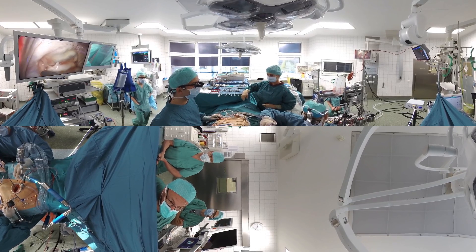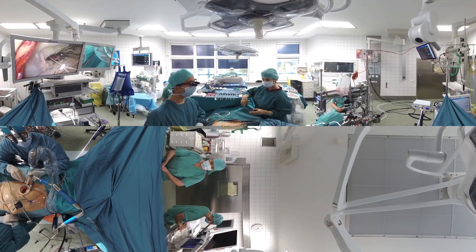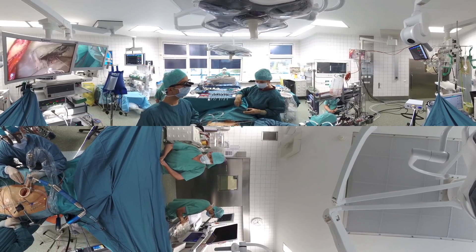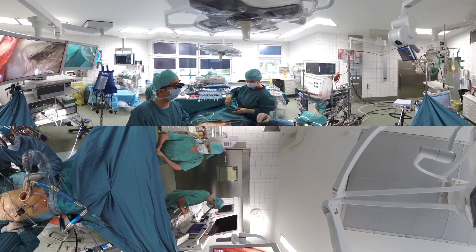In this case, we see that the posterior leaflet is markedly elongated with multiple broken cords that normally attach the leaflet to the papillary muscle. A water sealing test is performed in order to confirm that this is the only mechanism causing the leaking valve.